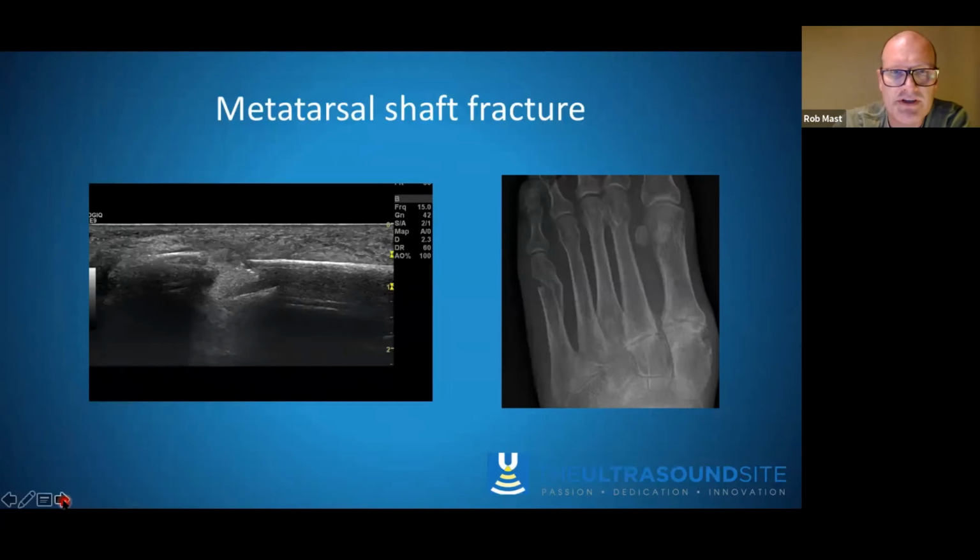I just wanted to touch on the accuracy of ultrasound in evaluating bone, because it's not something that traditionally is thought of as the main modality to evaluate bones, because that's more X-ray. And to be fair, it still is, because X-ray is the modality of choice to evaluate fractures. But there's quite a body of evidence now, and I have done some studies, to show that a randomized controlled trial was done in 2013.